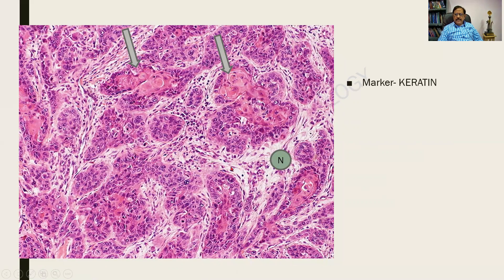Again, I find multiple nests of these tumor cells, and the arrows are pointing to the epithelial pearls. Epithelial pearls are a concentric arrangement of tumor cells which are more eosinophilic at the nidus. These are the various nests of the tumor cells, and the tumor can be seen infiltrating the fibrocollagenous stroma.